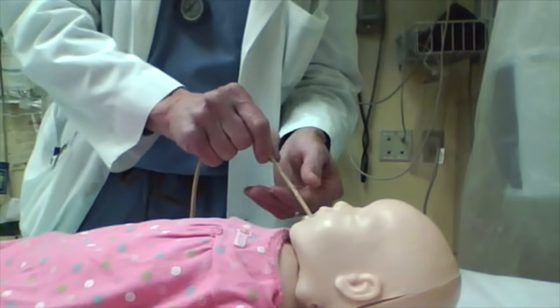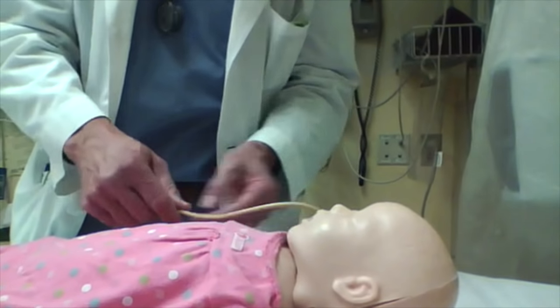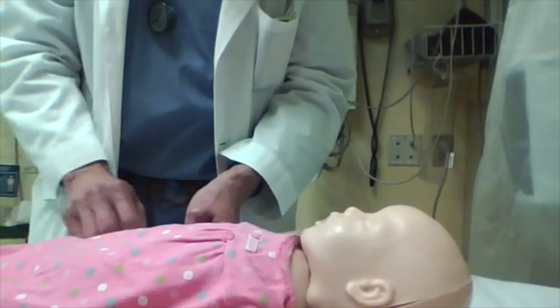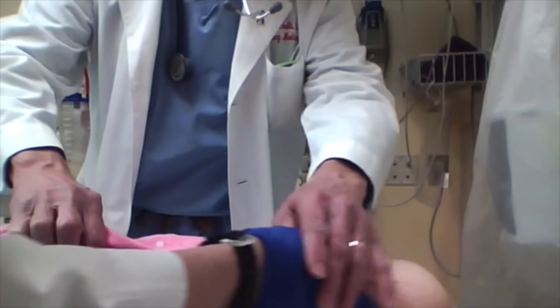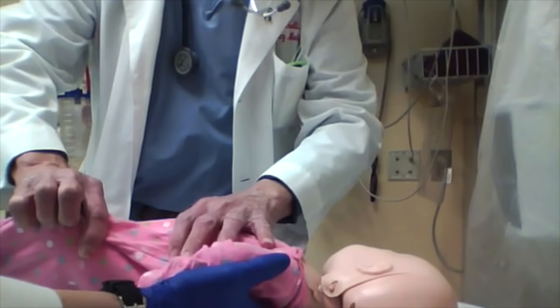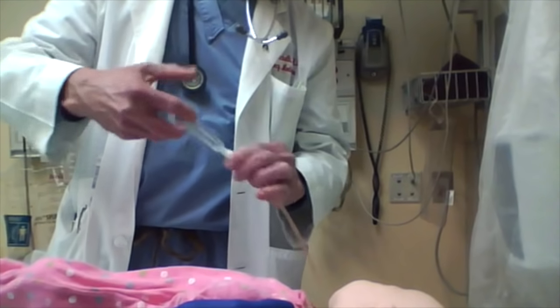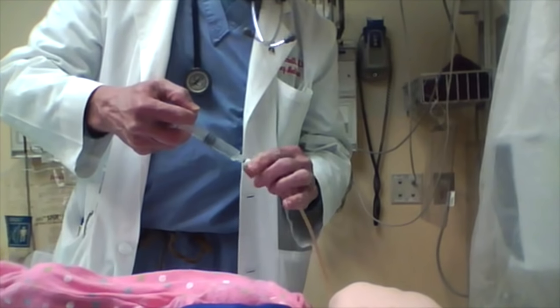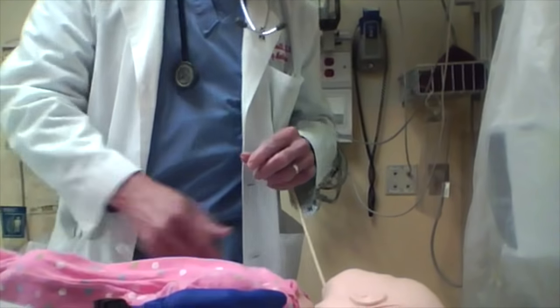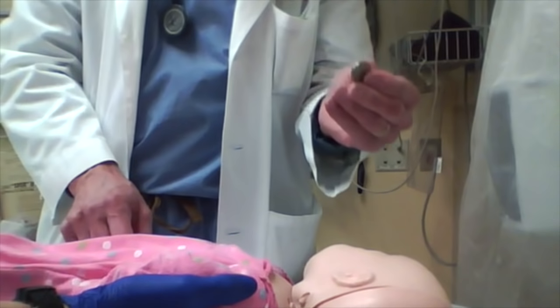The goal is to pass the tube through the mouth into the esophagus beyond the coin. Once it's beyond the coin — you can estimate this by just holding it up to the patient — roll the patient on their side or at least get their head rotated to the side, blow the catheter up. Generally 3–5 cc's is enough for a small child; a larger child you may need a little bit more. Just pull it — you'll feel a little tug and the coin will come out.